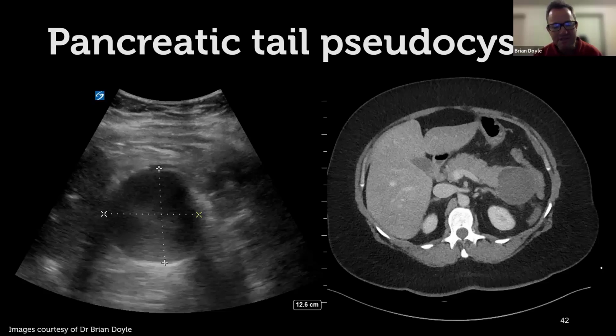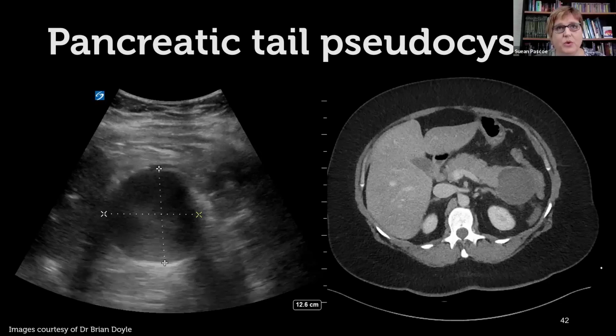I'm not entirely certain. The other thing about that cyst is it looked like it had an internal echogenicity to it. I always thought of a cyst as being an anechoic structure, but I like how Suean pointed out that these are full of debris. So I thought it was more of a mass at first instance, but anyway. I think the most important thing here is that there's going to be a lot of times when you don't know what it is, you just know it's not right.